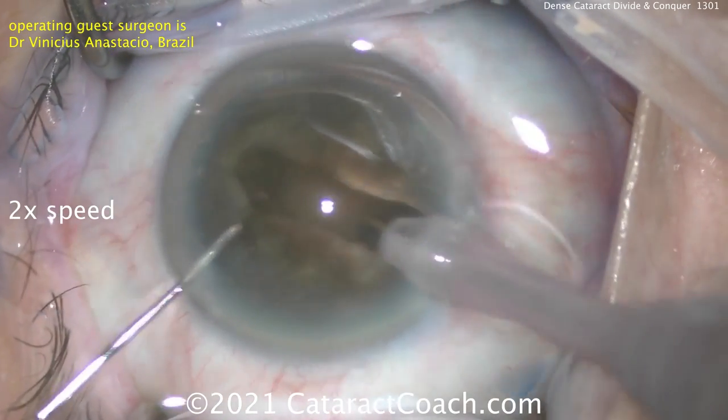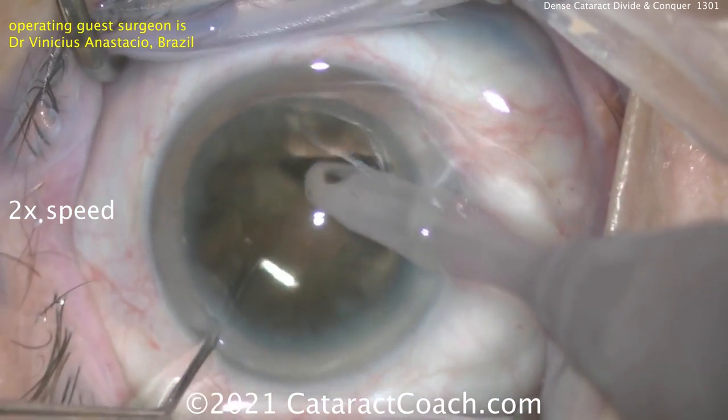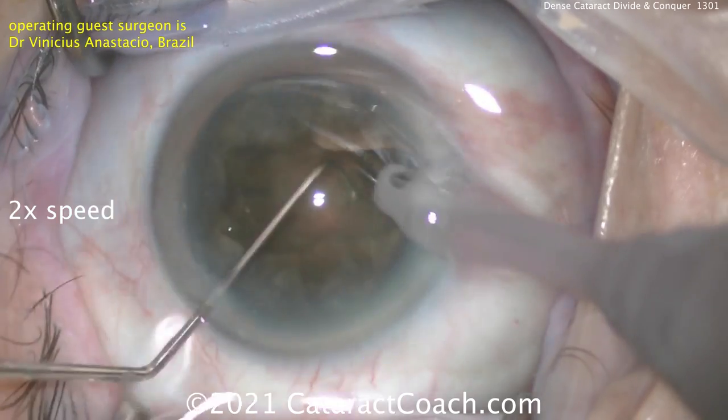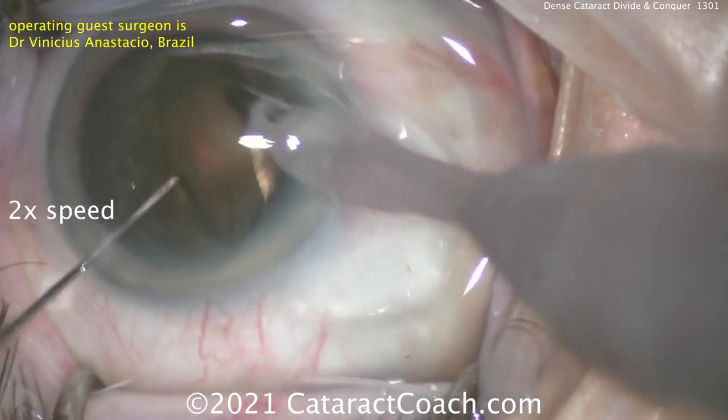Rotating it 180 degrees to continue the groove and really get down deep enough. Remember, this may have a dense posterior plate. There's a little bit of a crack, and you can see how he propagates the crack all the way through to really separate that posterior plate.